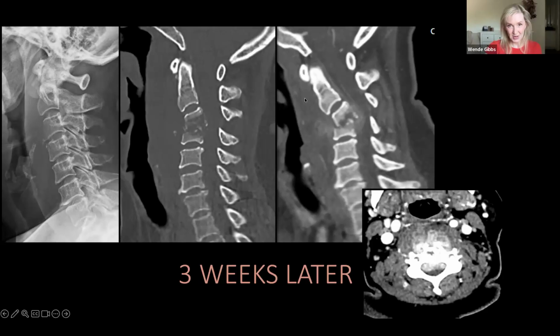So in this picture here on the end, you can see the epidural phlegmon and the prevertebral enhancing tissue as well. So you know that this is going to be a pretty significant case, maybe even abscess. Here on the bottom, it's actually covered by my pictures of the people, but there is epidural phlegmon and prevertebral phlegmon.